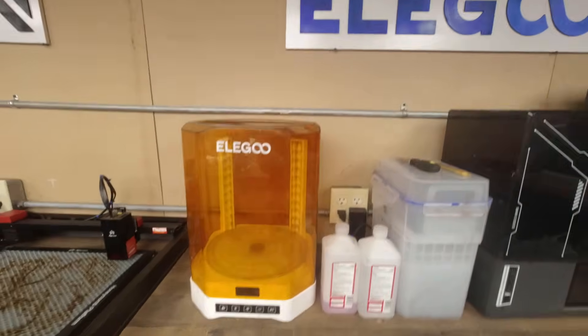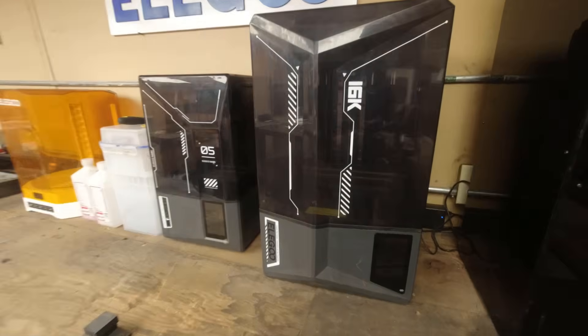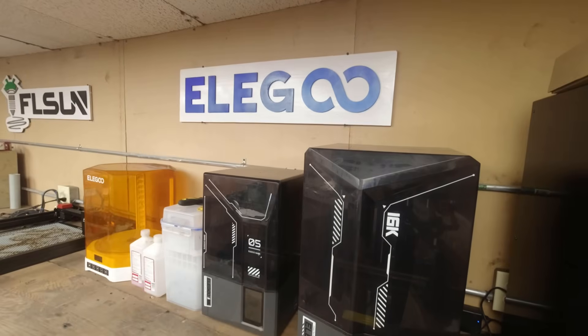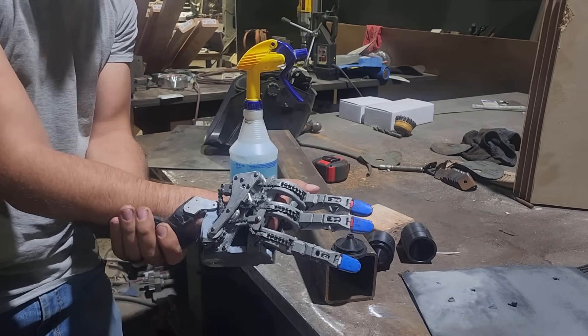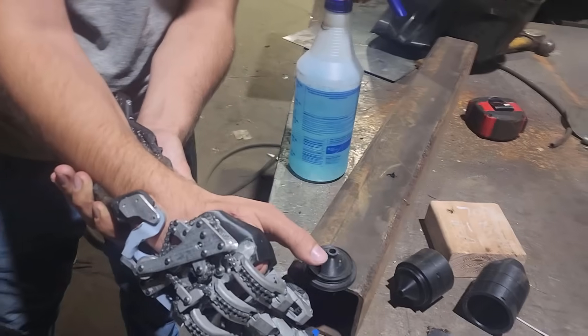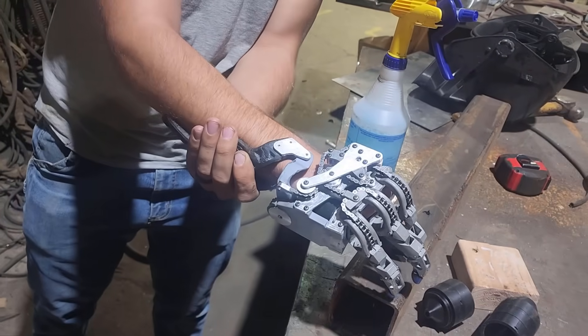Thanks to the new resin printer and wash station that Elegoo recently sent me, we were able to get all of the custom pieces of the prototype iterated and ready to machine from aluminum. By the end of the second day, we had the rough workings of his hand together enough that he was able to very carefully use it to pick up a couple of small things off my welding table.